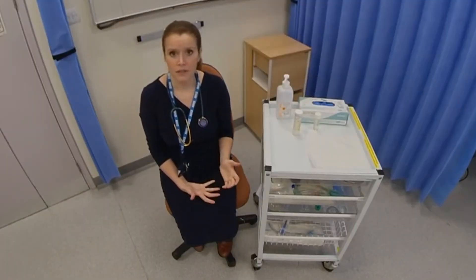Hi, my name is Dr. Allum. I'm one of the medical doctors. So we're going to be talking through how to perform a urinalysis.